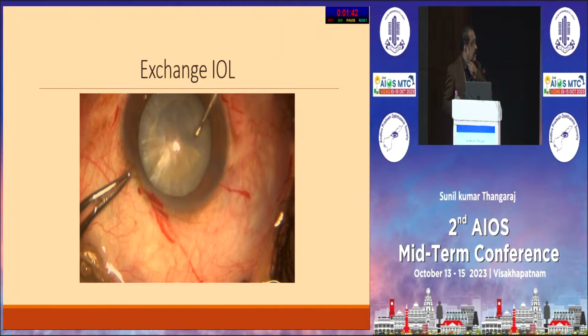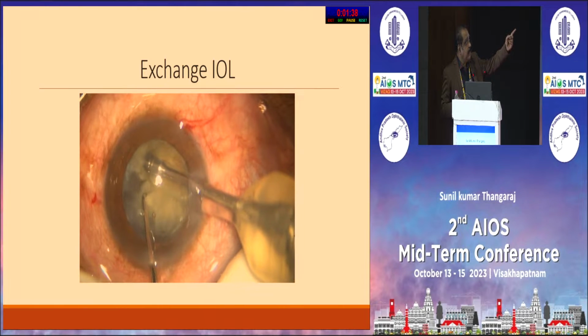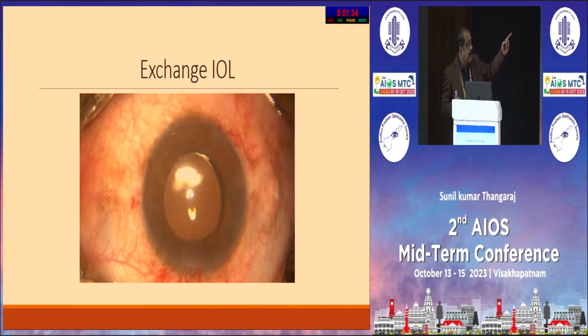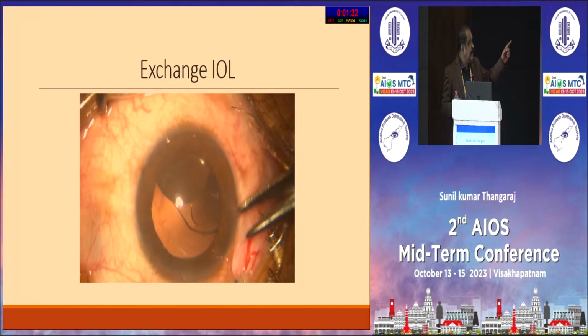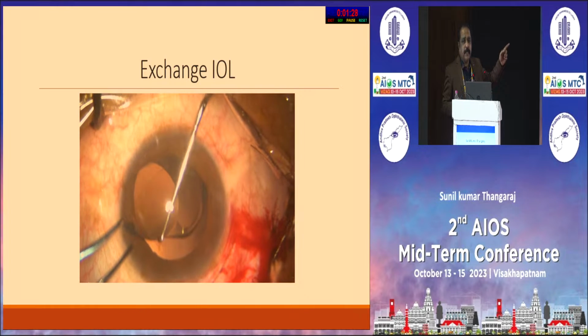And here, this is actually an intumescent cataract. The rhexis ran away inferiorly, but I went ahead with my phaco. I realized the rhexis had gone posteriorly, put in the lens, and the next day I realized that the lens is sinking.